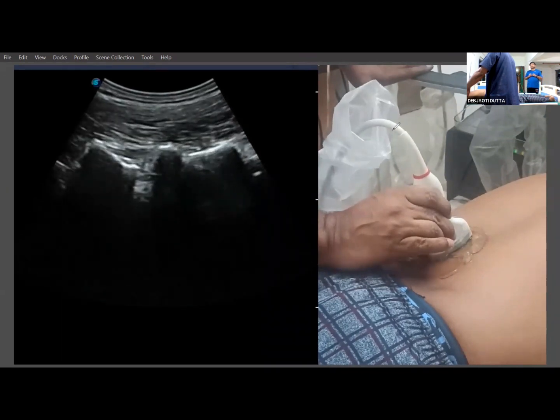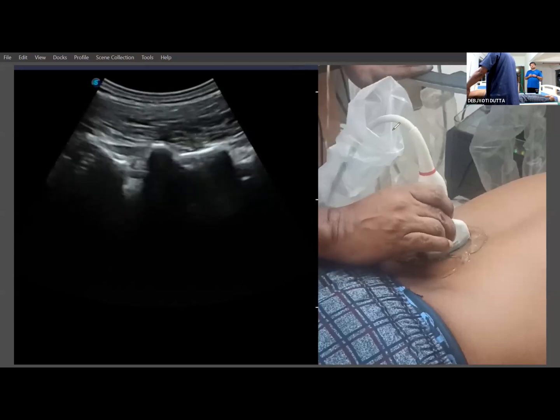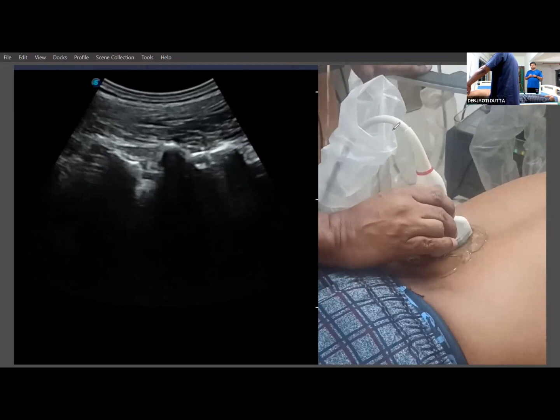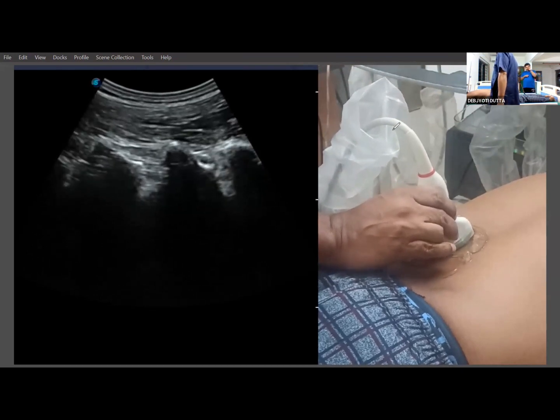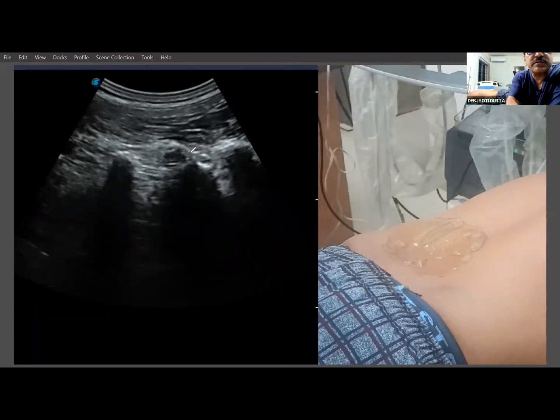Here in this view, we can see the neurovascular bundle, and if you make a little bit of medial tilt, then we'll be able to see it better. But here we have our own technique, and I'll be showing the video also. At this point, what we do is keep the caudal end over the mammillary process below, and above I'll be tilting. So here you see, this is your articular process and this is below, depth is below.